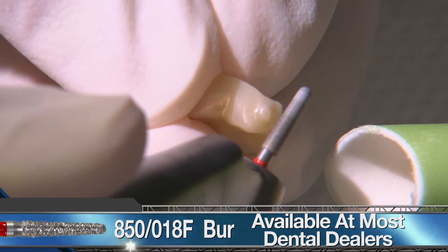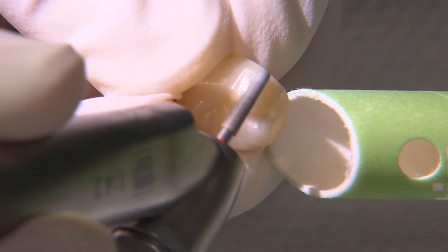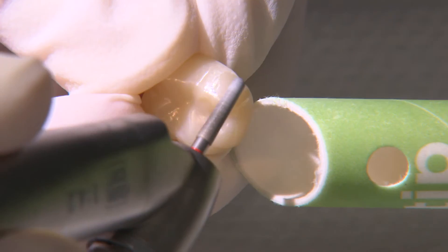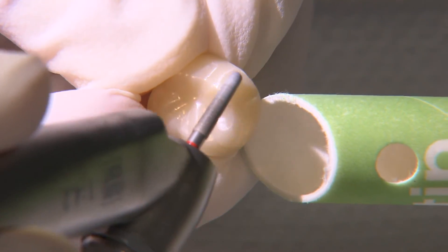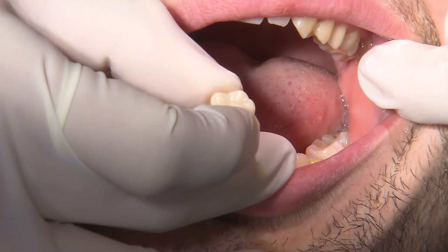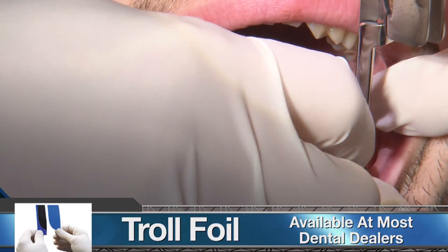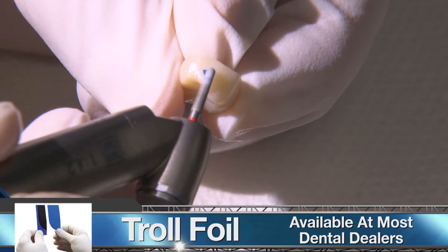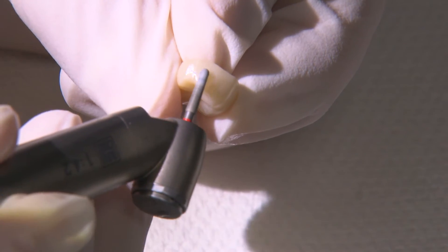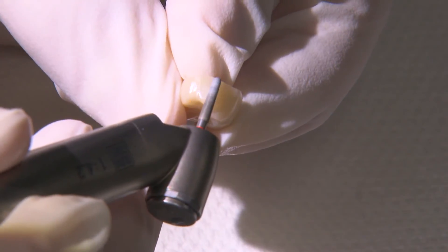Hello, and welcome to Chair Side Live. I'm your host, Megan Strong. Thanks for hanging out with us today. Dr. Chi is removing an over-contoured gold crown on number 19. It was trapping food and causing severe gingival irritation. So let's watch as Dr. Chi works his digital dentistry magic and places a Bruxer Now crown in a single appointment using the Glidewell.io in-office solution. Dr. Chi?